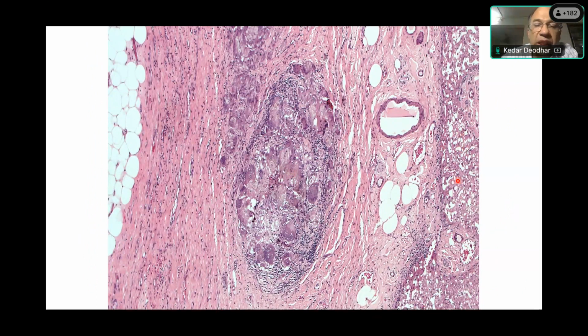And this is an area of the gallbladder fossa, and we often see foreign body type giant cell reaction, fibrous reaction, patchy inflammation, cholesterol cleft formation. This is what we commonly see.